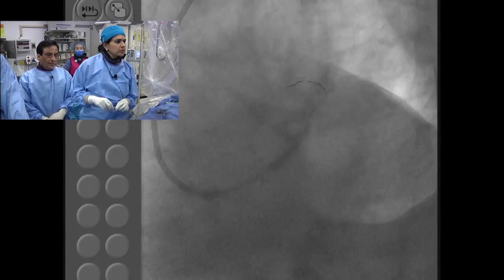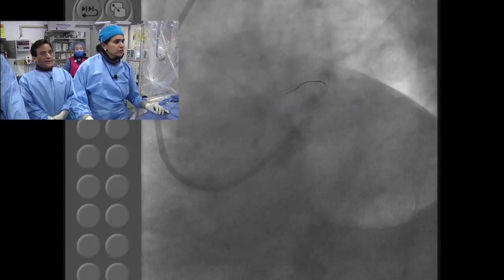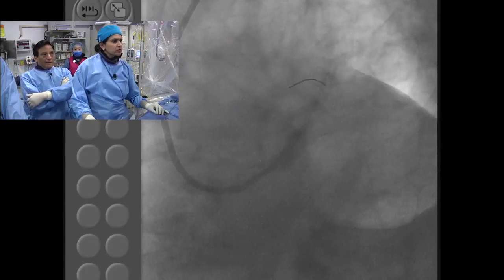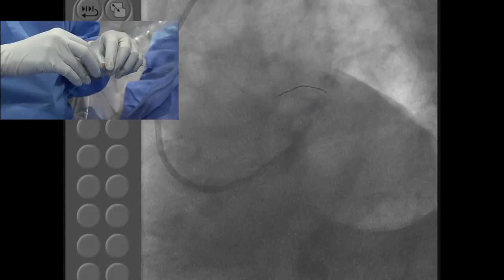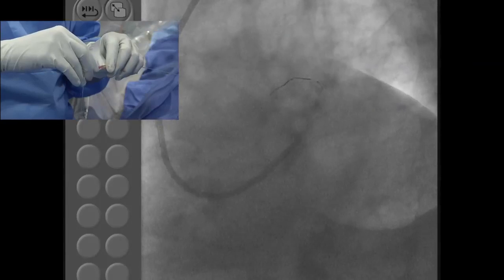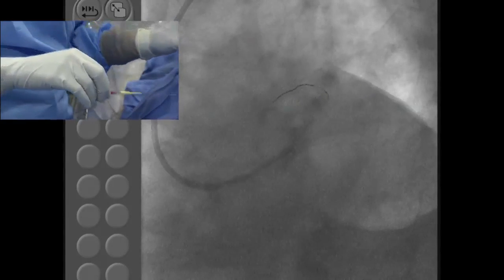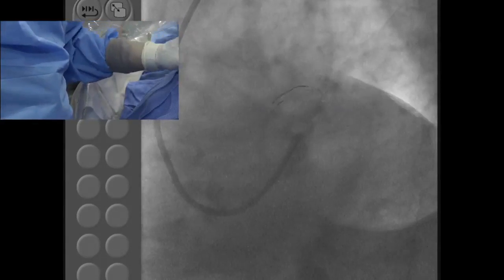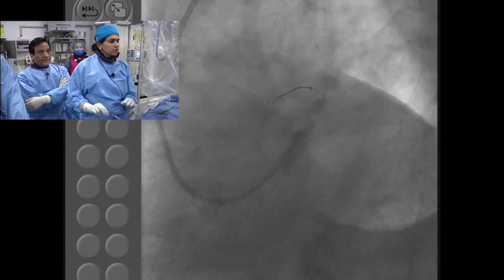The fourth case actually had some issues with the guide catheter and was not done. So that is our track record. But when we put our protocol in place and understood all the steps, we went ahead and did our one live successful retrograde case with the Japanese back in 2011. And last year, as you saw, a standalone retrograde case was done by Anu. That was the first independent retrograde case in the CCC symposium.